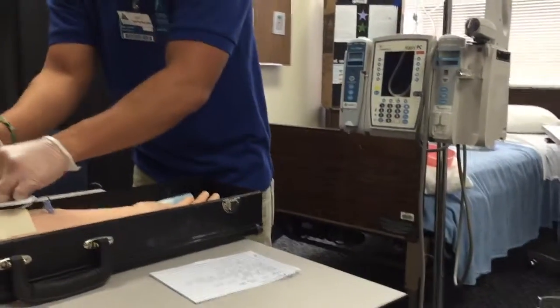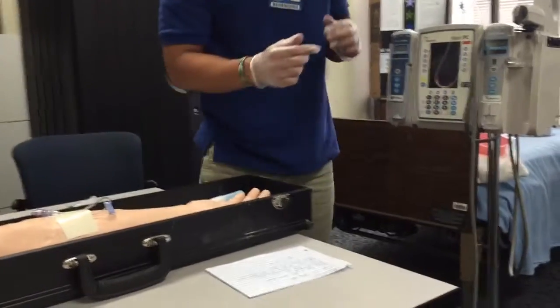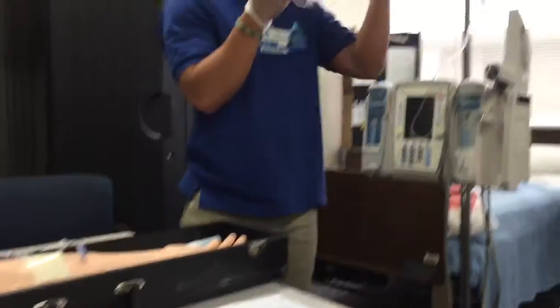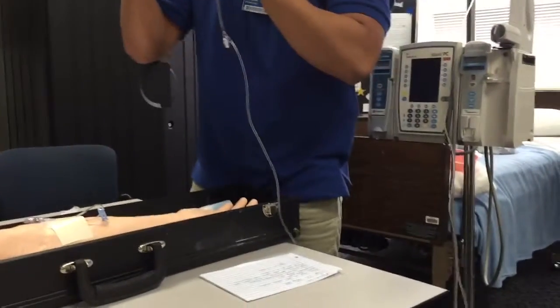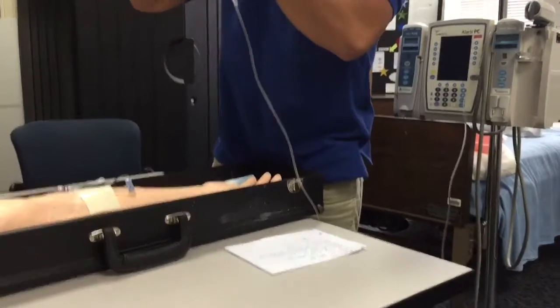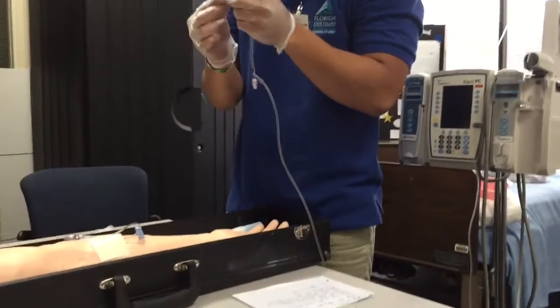I'm going to cleanse the site with another alcohol, just to make sure it's clean. That's good. I'm going to go ahead and grab my mini bag. This tip is on there so it would still be sterile. I'm going to go ahead and take this off. You can dispose of this. And then that's already an alcohol swab.